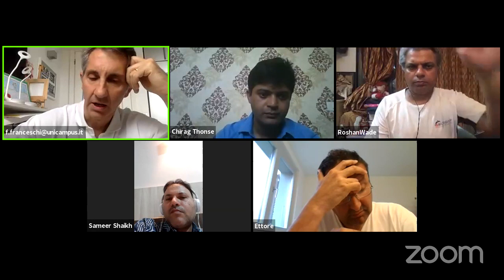How much percentage of osteolysis have you seen in this double button, endobutton group? Unfortunately, I started with this experience only since September. So it's almost impossible to observe osteolysis. Anyway, I think that the percentage of osteolysis is less than in the bone block procedure with the xenograft, because we have a very vascularized autograft. So I think that it should be better. We have to ask Ettore, who has made both experiences.